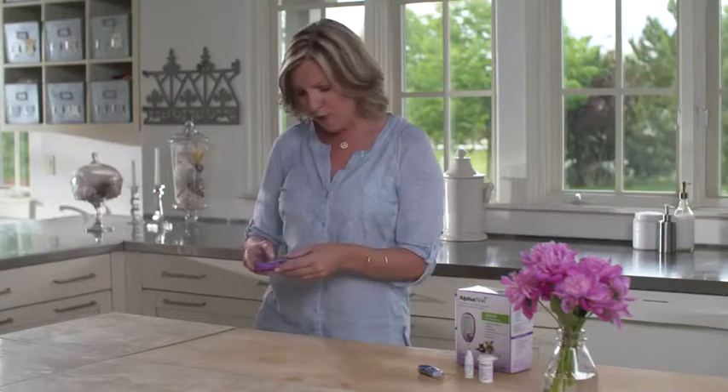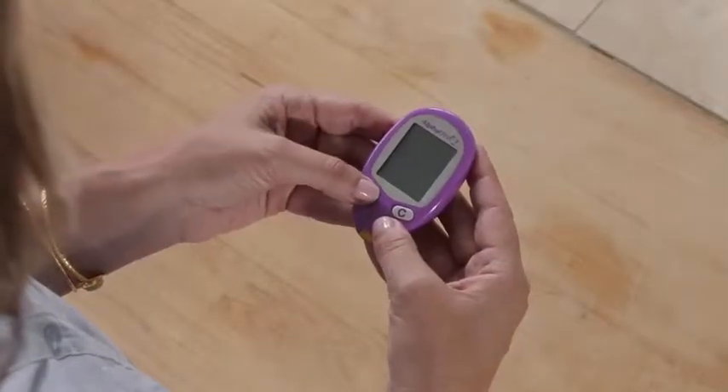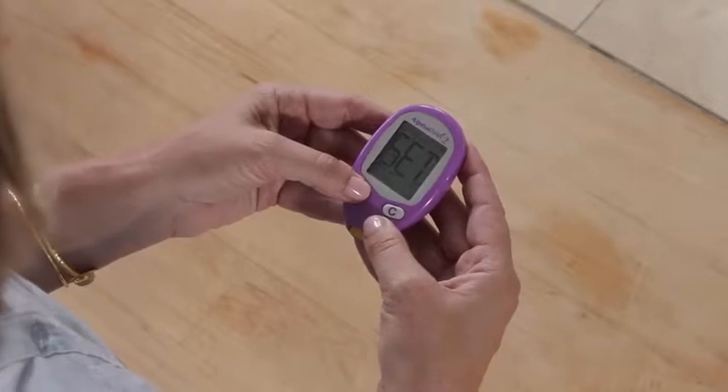Before you can do a test, you have to set up the sound, time, and date. With the meter off, press and hold the M button for three seconds until 'set' appears. Press M again to bypass the optional reminder alarms — you can set these up at a later time. Before setting the sound, note that with the sound on, the meter will beep when the test strip has enough blood and the test result appears on the display, or when an error occurs.